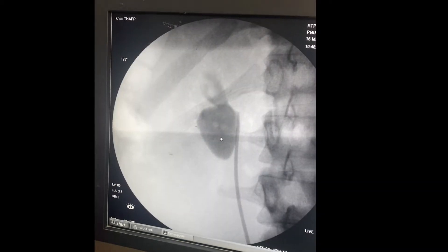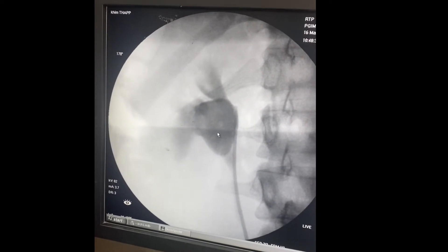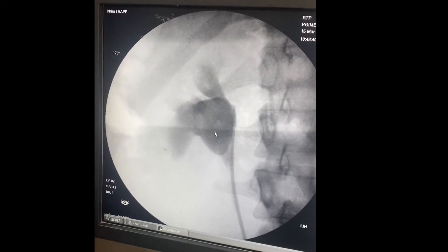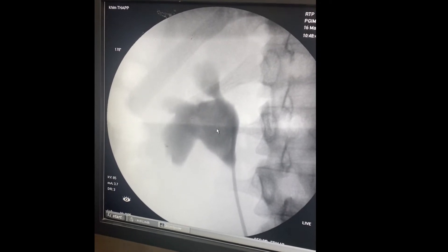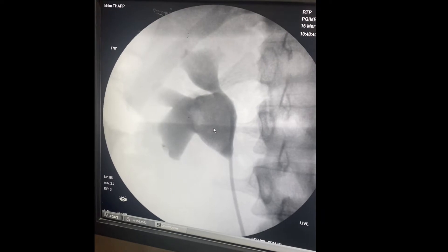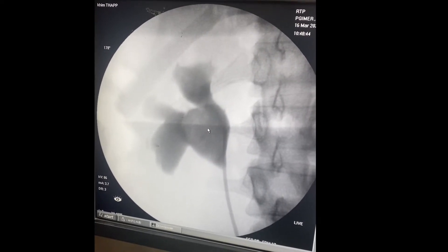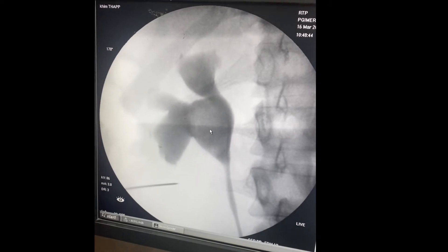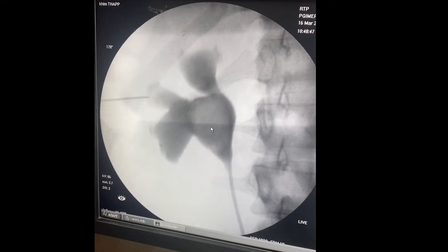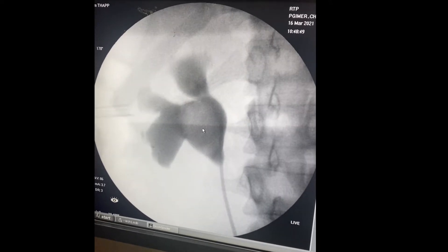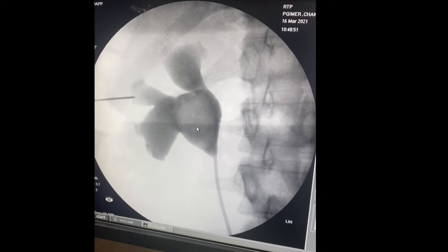On performing RGP, you can see that the dense contrast initially settles in the anterior calyxes during prone PCNL. Slowly the calyxes are getting opacified. Focusing on the middle calyx, the calyx oriented more laterally is the mid anterior calyx. The posterior calyx is not seen initially.